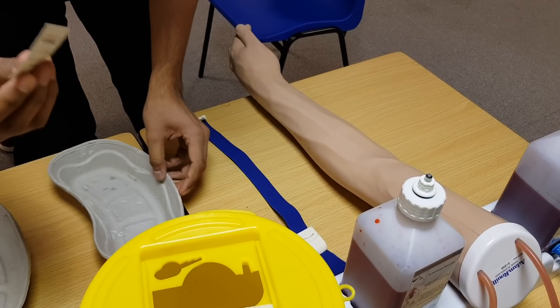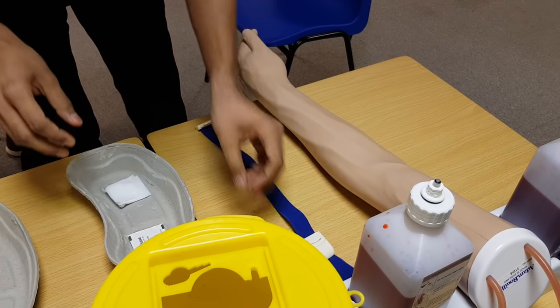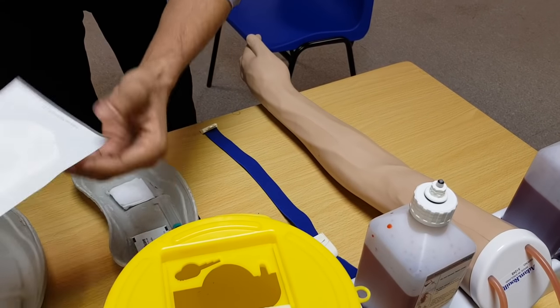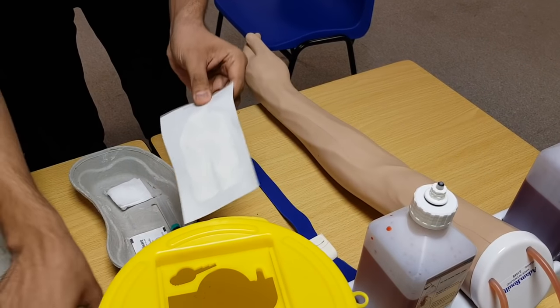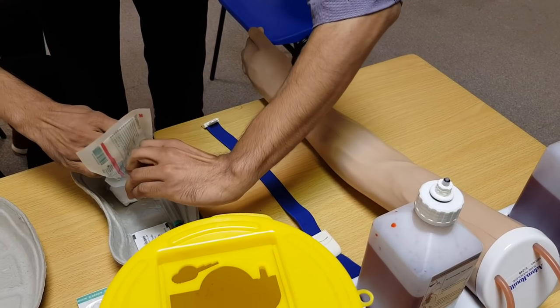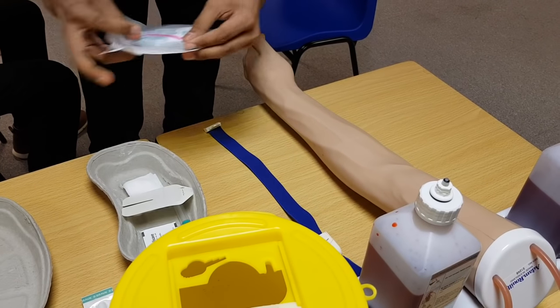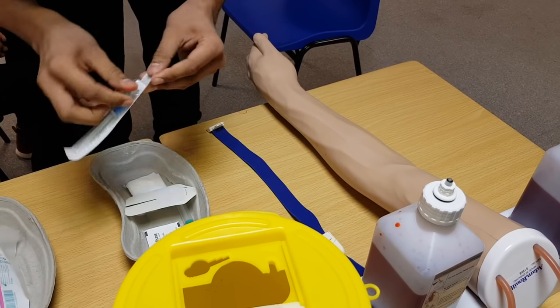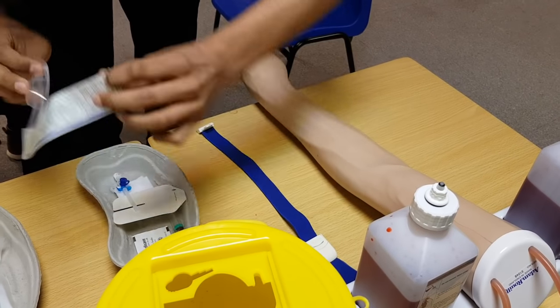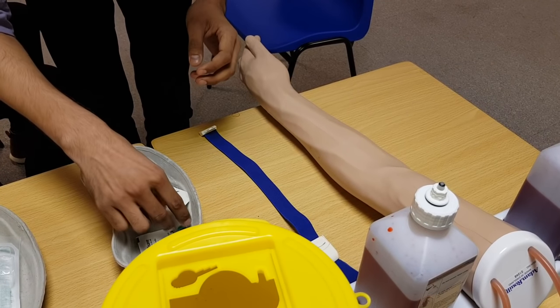So we'll take an alcohol swab, a gauze piece, syringe first, and we'll take the Tegaderm and cannula. Open with non-touch technique and drop them into the neutral field. Examiner, where is my clinical waste area? Thank you. Open the cannula with non-touch technique. I assume I am gloved.